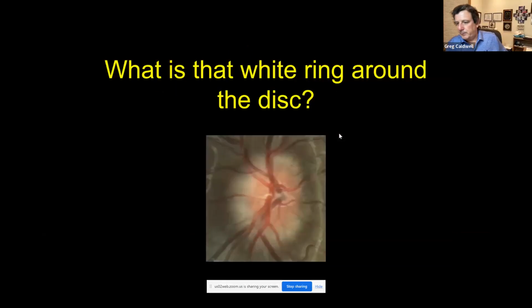And Len, that's a great point here. Let me do the one question, because it always seems to be a great question. It says, does the OCT appearance of the disc drusen look differ in children versus adults? And I'll pause there on that question.